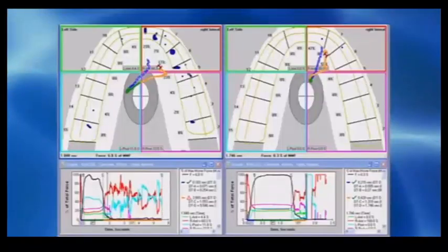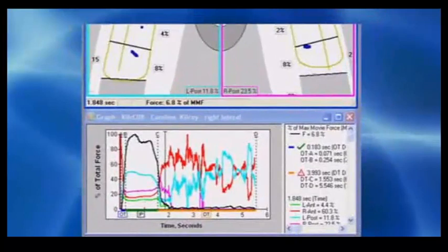In order to compare the before and after right or left excursions to each other, you need to look at how far into the excursion preoperatively compares to when the person discludes postoperatively. So here in movie 08, the timeline is to the right of C in the graph, 0.428 seconds, which is the actual postoperative disclusion time.